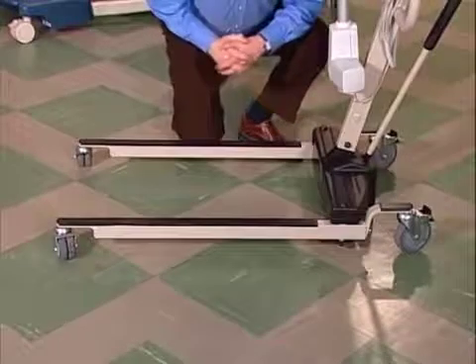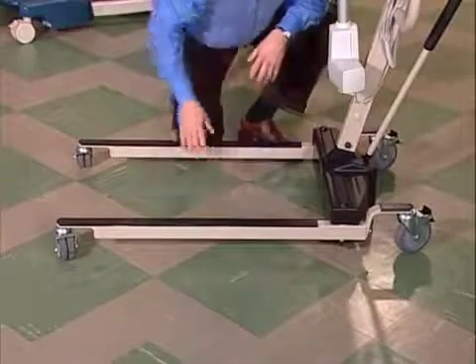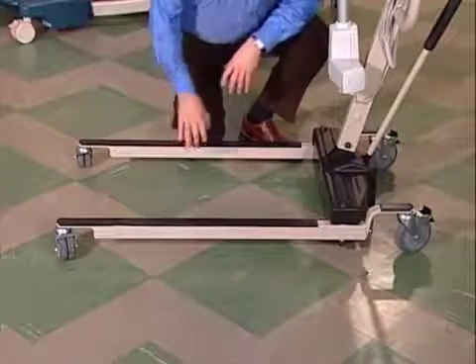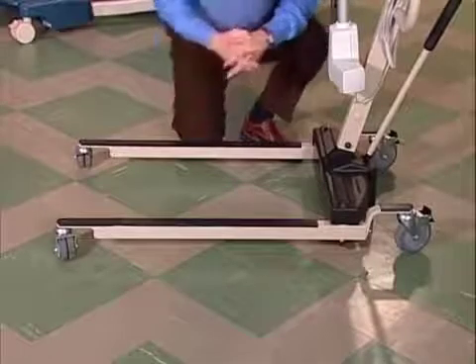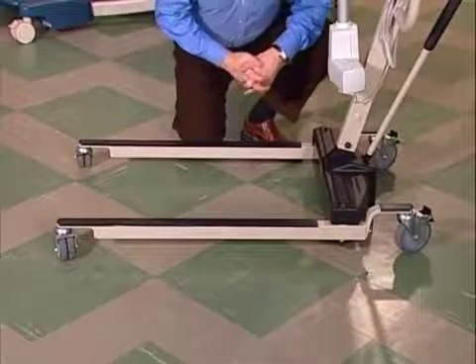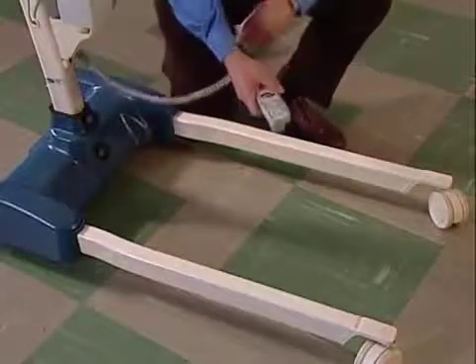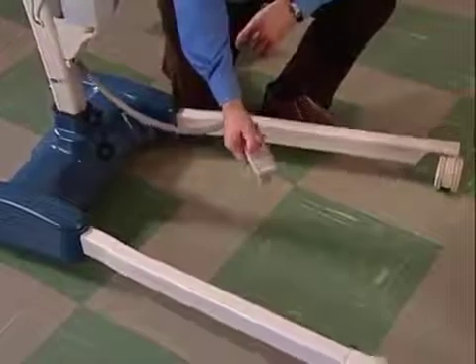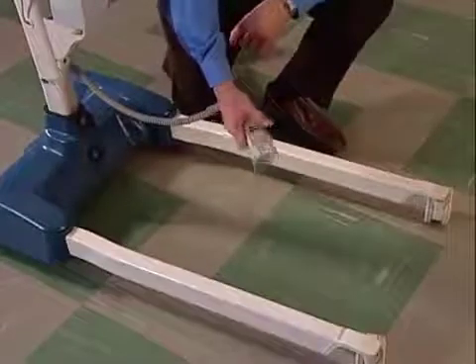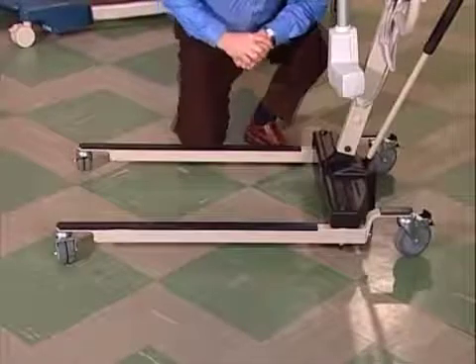You'll see later. Next are the legs. There are 2 of them, and they're adjustable. With the legs closed, the lift can be maneuvered more easily through doors, around furniture, and in tight hallways. Jasmine lifts and some Reliant lifts have motorized legs that open and close with the touch of a button. Other Reliant lifts, like this one, have manually operated legs.